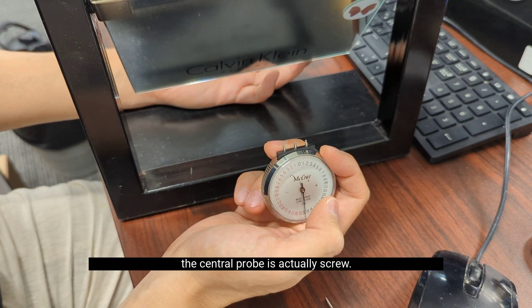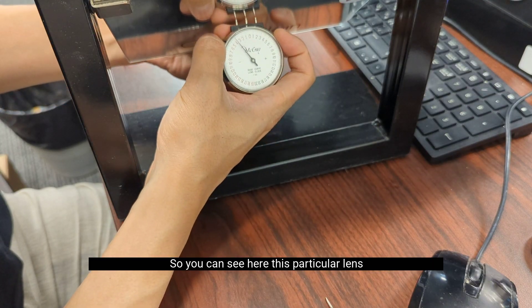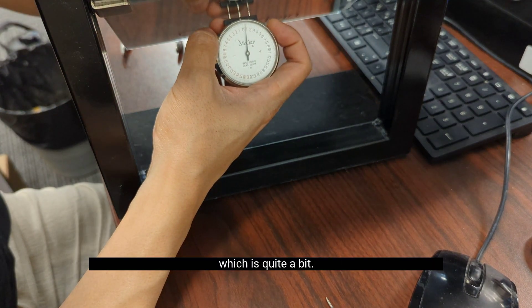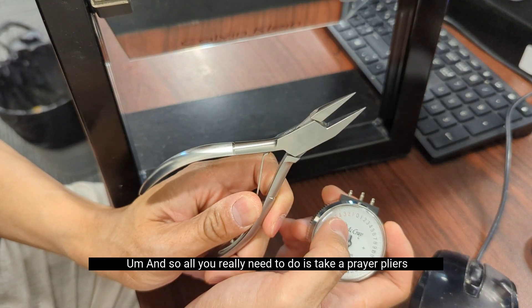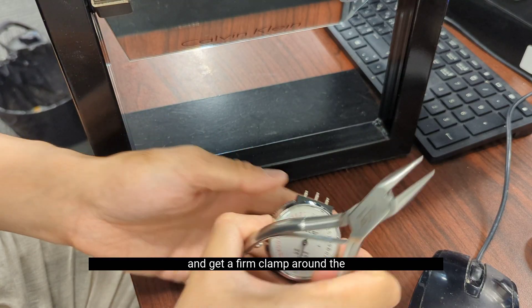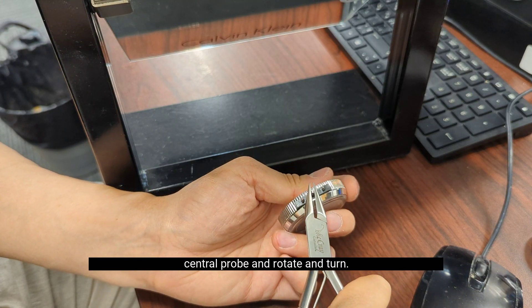The central probe is actually a screw. This particular lens clock is about one diopter off, which is quite a bit. All you really need to do is take a pair of pliers, get a firm clamp around the central probe, and rotate and turn.